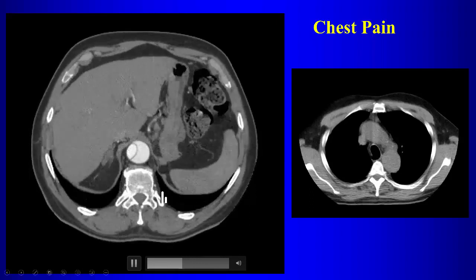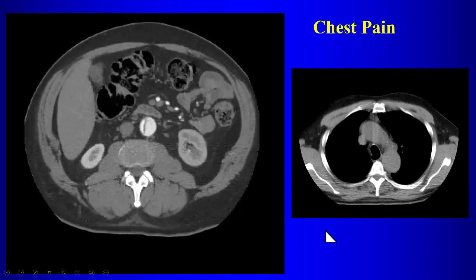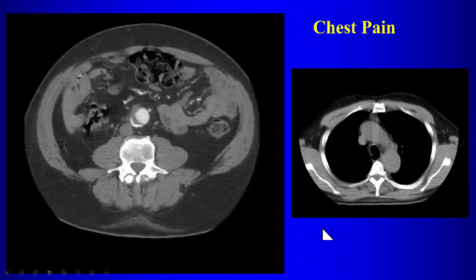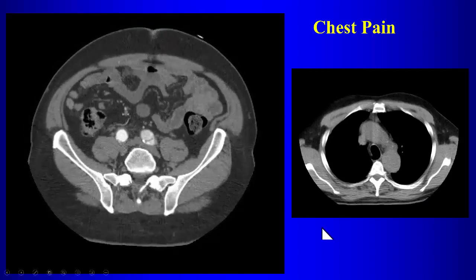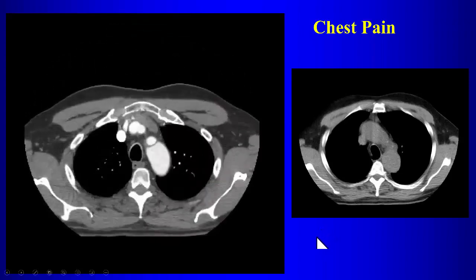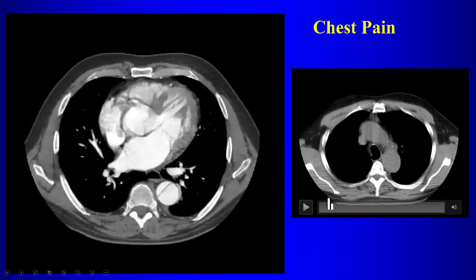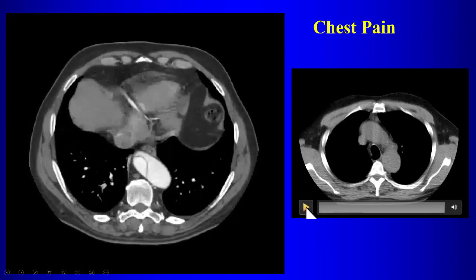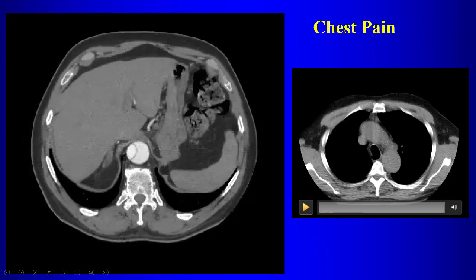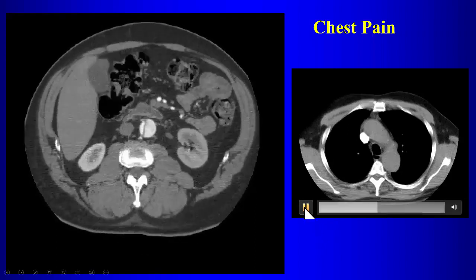So when we do the dissections and we give intravenous contrast, depending on what vessels you're looking at, whenever you do vascular angiography studies, you need to be able to time the acquisition of the imaging to when the contrast is in the vessel you want to evaluate. So if we're looking at the thoracic aorta, GE calls it smart prep.